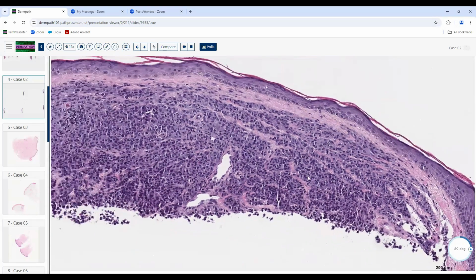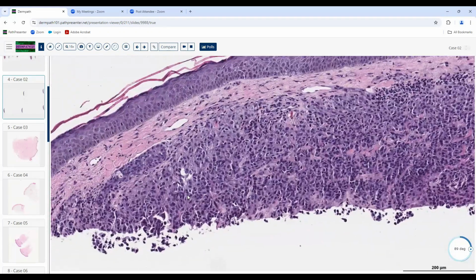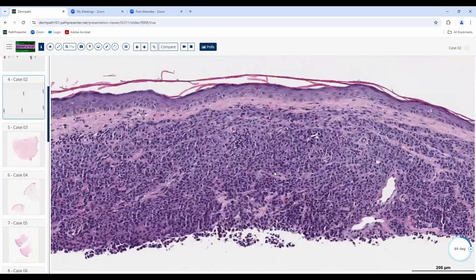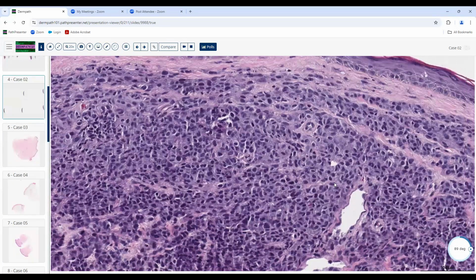We're not really going to slam dunk it into a cancer just yet when we see something like that. We've got another area over here where there's some cells that are kind of coalesced. And then we notice here, we'll go back to that area that I showed you a second ago, and lo and behold, there are mitotic figures in here.